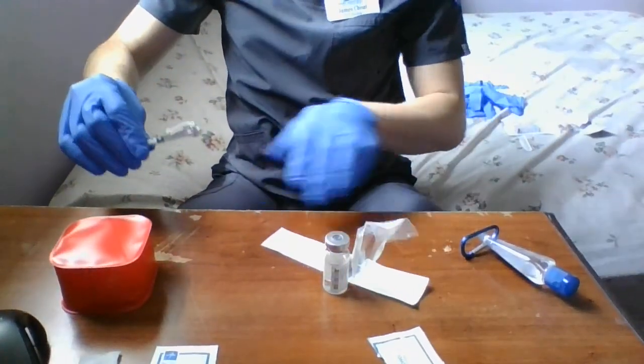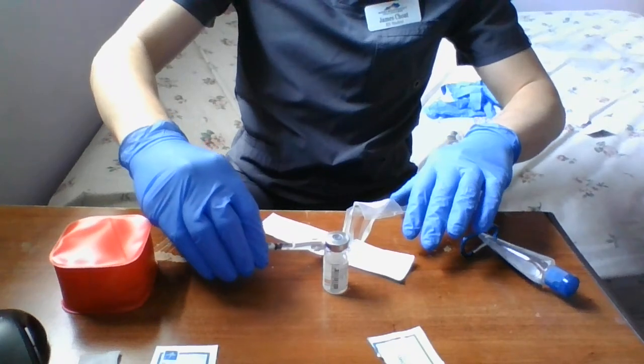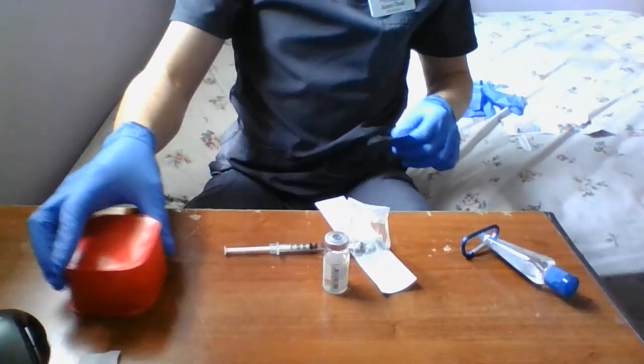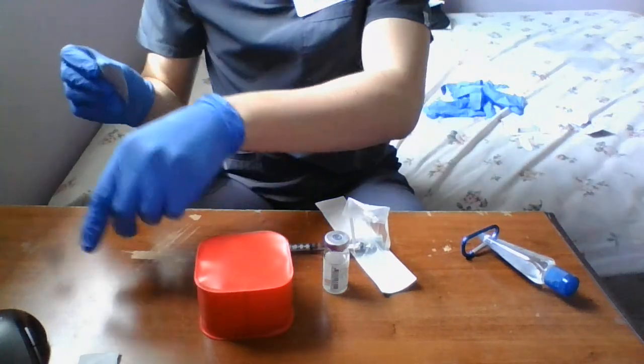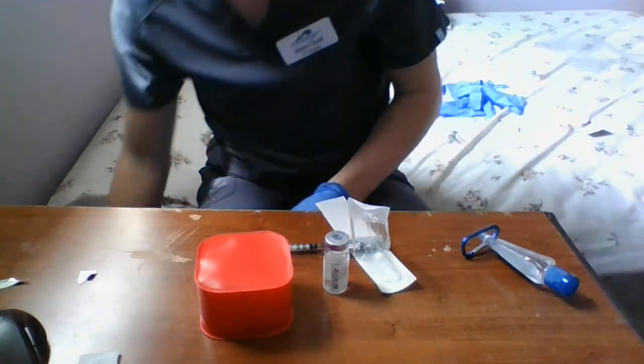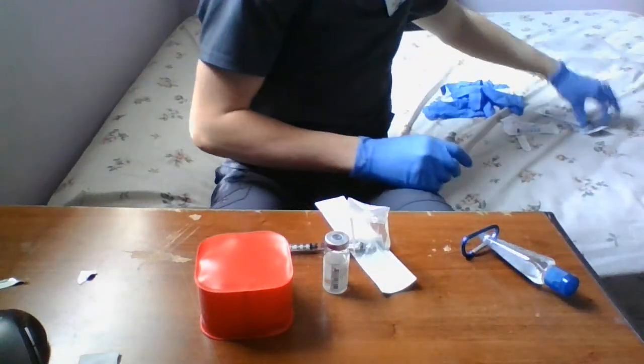I'm going to swoop it down to just cover the needle with this cap real quick. I'll get the alcohol pad ready. And that's why I got several out.